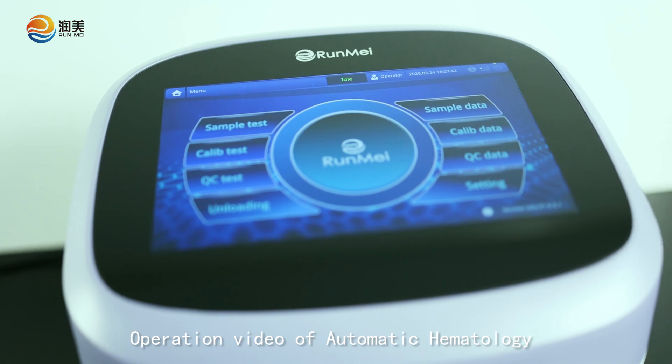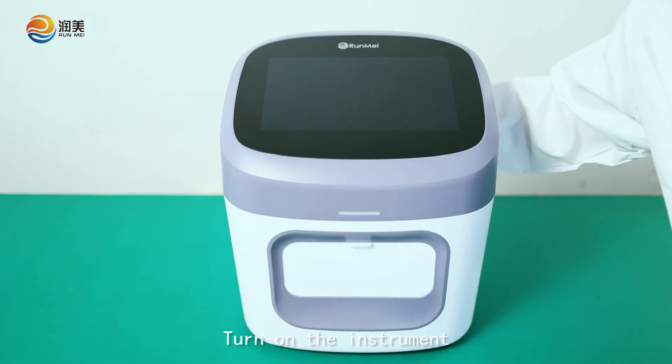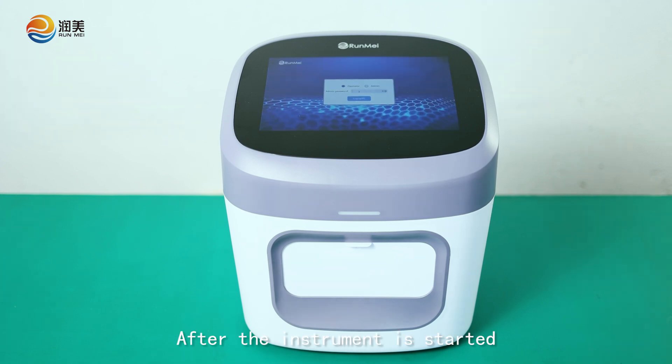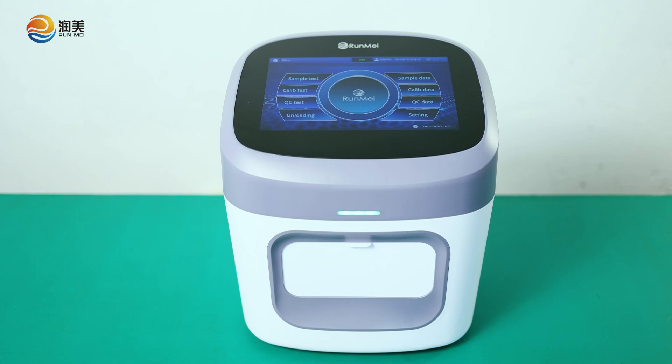Operation video of an Automatic Hematology Analyzer. Turn on the instrument. After the instrument is started, it will initialize and conduct a self-test.